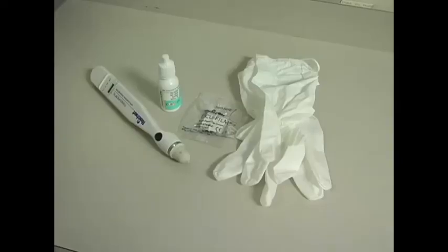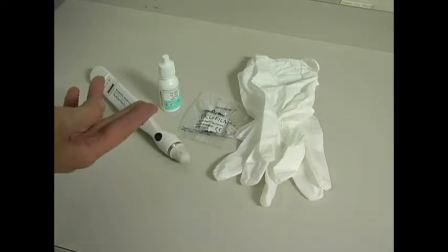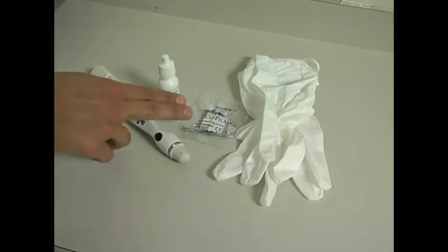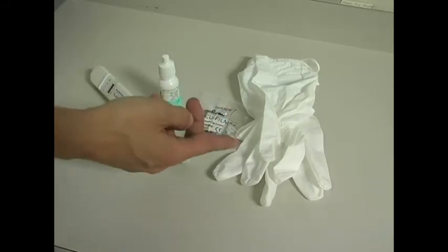Contraindications to tonometry include suspicion for a ruptured globe, acute traumatic hyphema, where a ruptured globe cannot be ruled out, and the uncooperative patient. Contact lenses should be removed before performing any tonometry. To measure intraocular pressures with a Tonopen, the following equipment is needed: a pen tonometer, topical anesthetic, either proparacaine or tetracaine, Tonopen tip covers, and examination gloves.